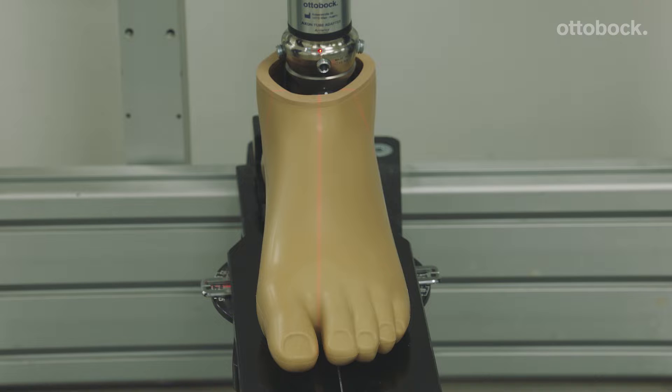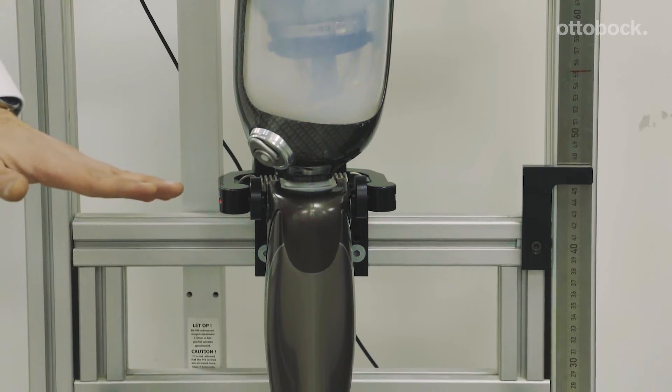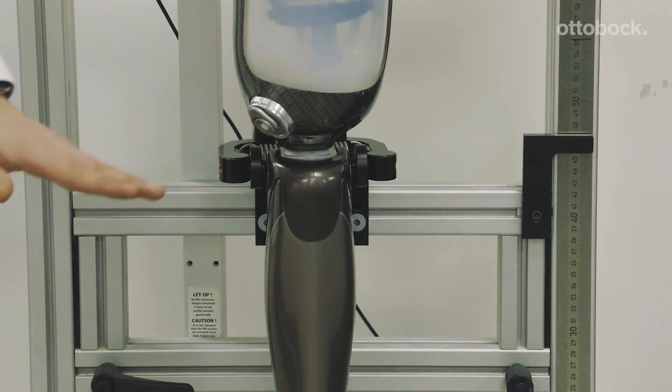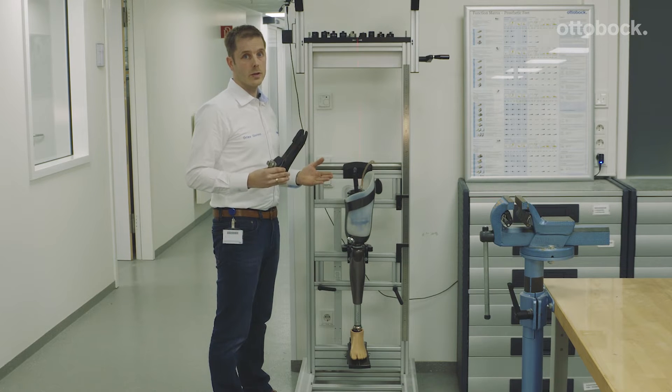We have certain alignment recommendations and you have to follow them. For the rotation, it's given by nature. The knee joint is actually in 5 degrees of external rotation, and so is the foot — also in 5 degrees of external rotation. That's a really good starting point with the end user.